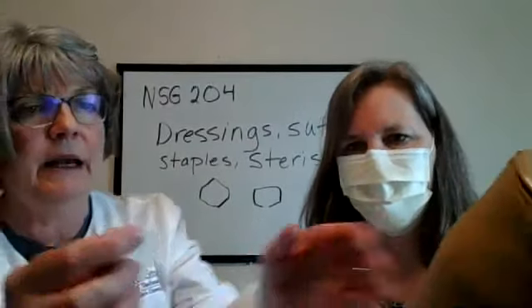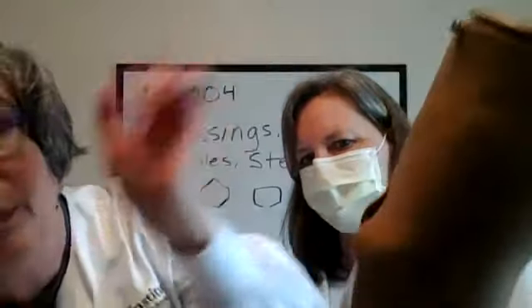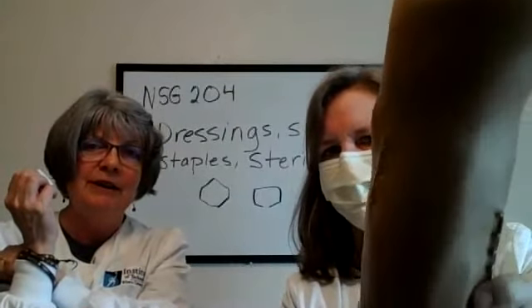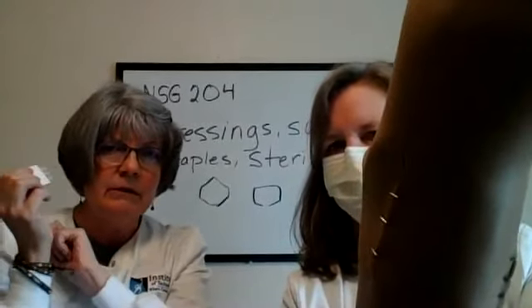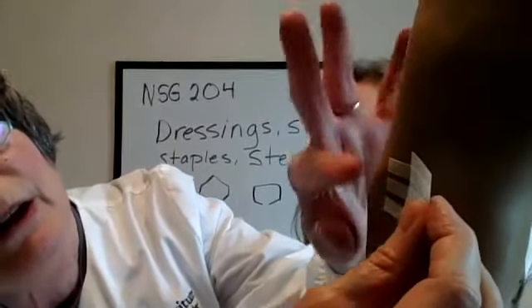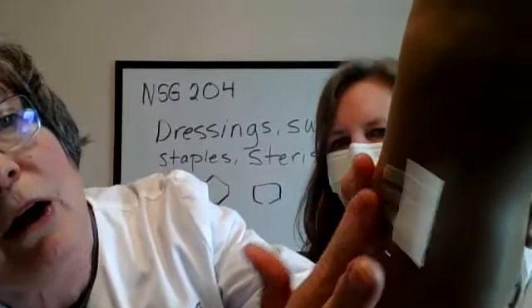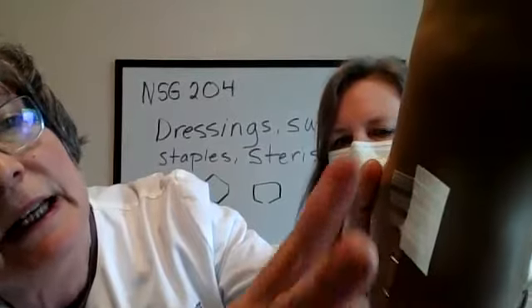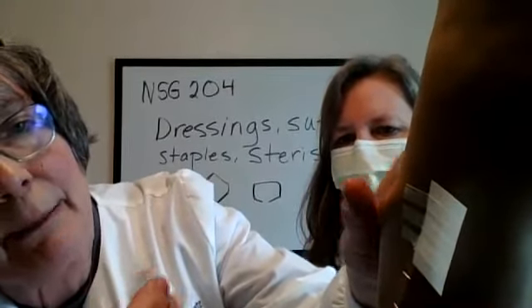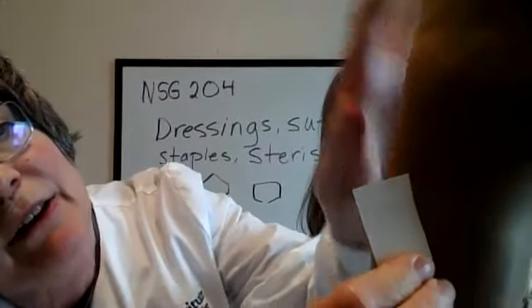And then what you want to do is, after you've put your skin protectant on, so that you keep your edges approximated, go ahead and lay all 3 of those strips on there because you've got them all nicely spaced. It's all smooth. These can get botched up kind of like tape. It can get stuck on each other and everything.